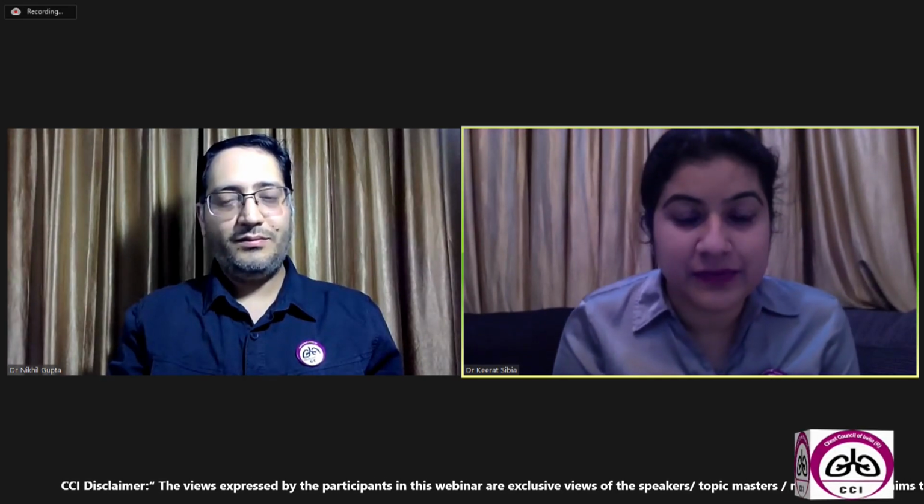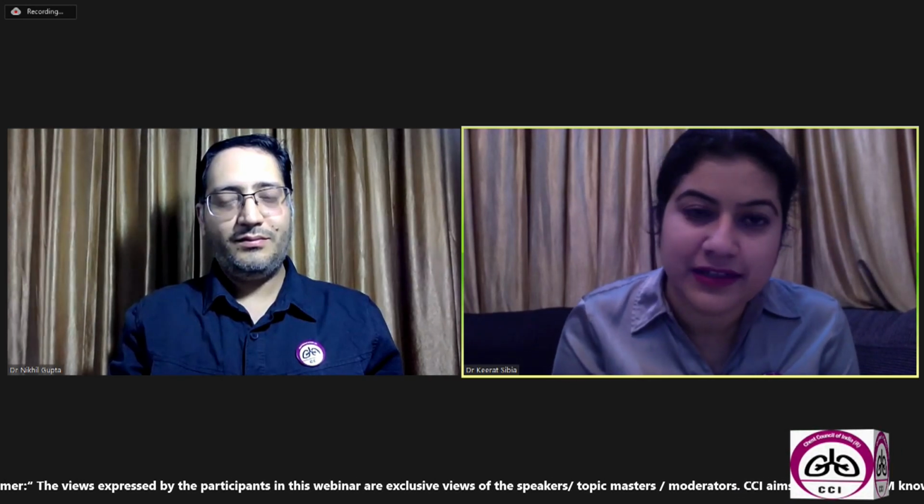So my next question to you is that when we see an X-ray in the normal practice, we might feel that the hila is looking prominent. So we're suspicious. So many times we might go in for an HRCT test because we think it is prominent, and it may or may not come out to be anything on the HRCT. I want you to elaborate on when do we look at a prominent hila and say it's actually an enlargement of the hila, a hilar enlargement.